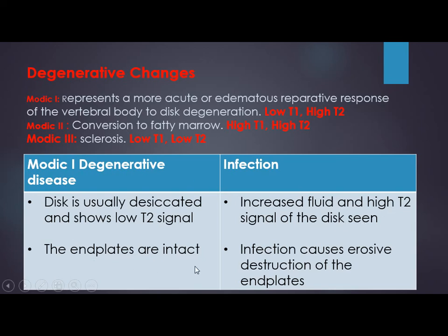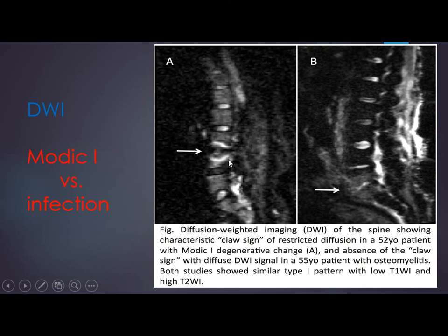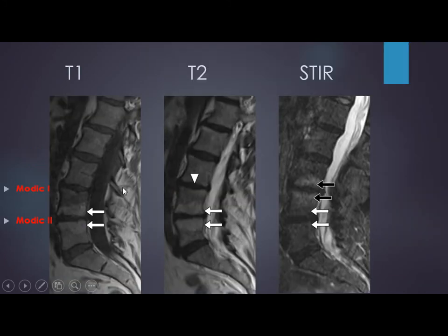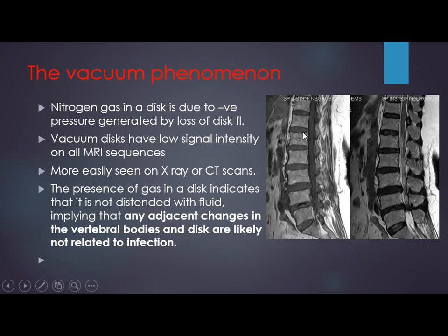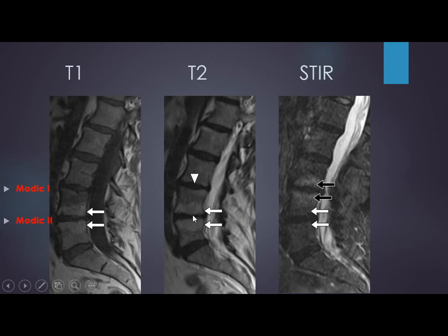On diffusion, we can differentiate Modic 1 from infection by a claw sign on diffusion in Modic, which is not seen in infection. This case has both Modic 1 and Modic 2. Modic 2 is high on T1, high on T2, suppressed on STIR — representing fat. Modic 1 is low on T1, higher on T2. The disc is desiccated on T2, and not expanded, confirming this is Modic change, not infection.